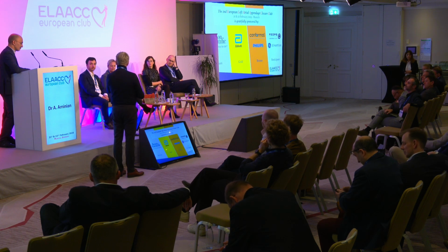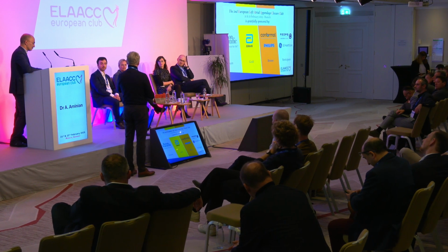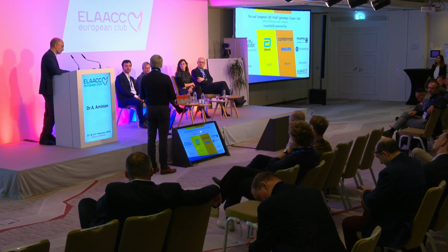And do you agree on that? Because that's not the message out there. It might be useful for other cardiologists or implanters to accept that this is actually something that is uniform both for CT and TE. I mean, nobody wants senseless follow-ups. I think we all agree on that. So we shouldn't look for something if you have the understanding that a low-grade thickening, whatever it is, on the device has no prognostic implications for the patient. I think it's very reasonable not to go for additional follow-ups.